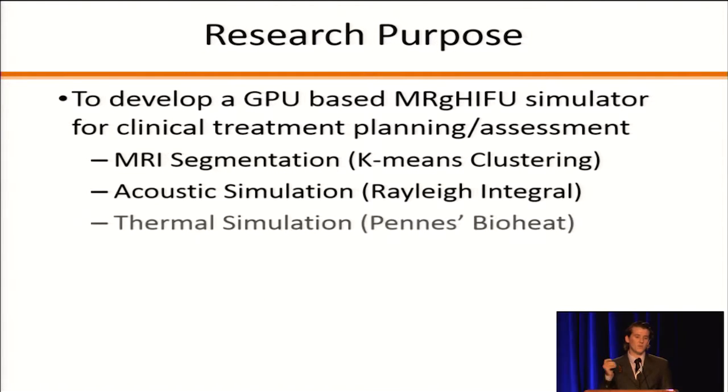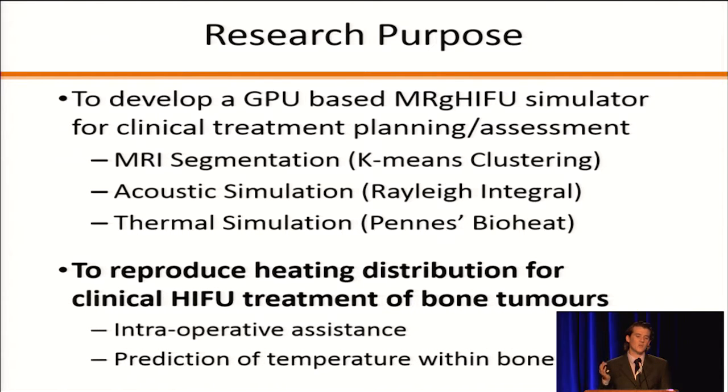The purpose of this research is to develop a graphical processing unit-based MR-guided HIFU simulator in order to enable clinical treatment planning as well as assessment. And there's 3 components involved. First is the MRI segmentation component, which uses the k-means clustering algorithm. Second is the acoustic simulation, which uses the Rayleigh integral. And finally is the thermal simulation, which uses the Pennes bioheat transfer equation.